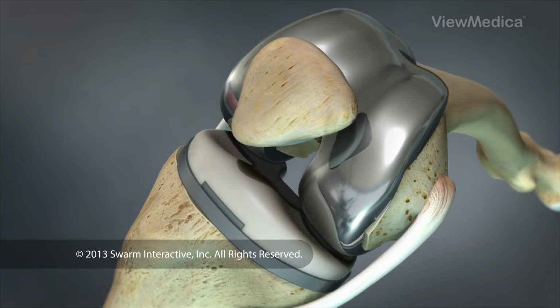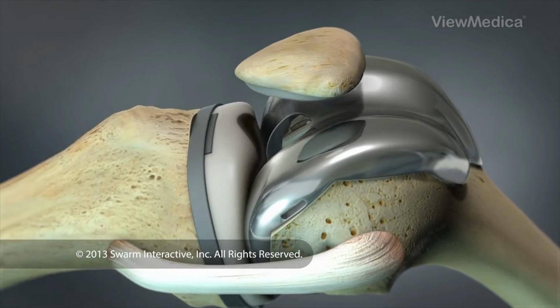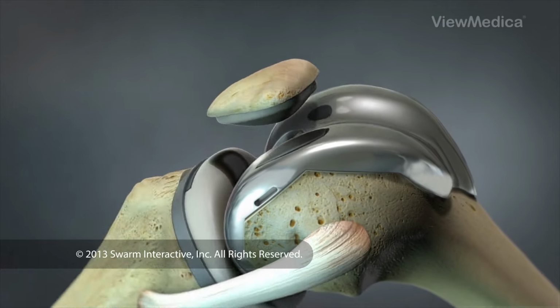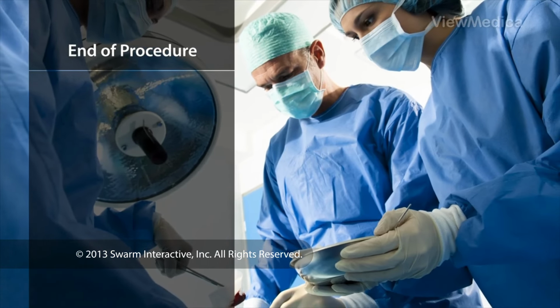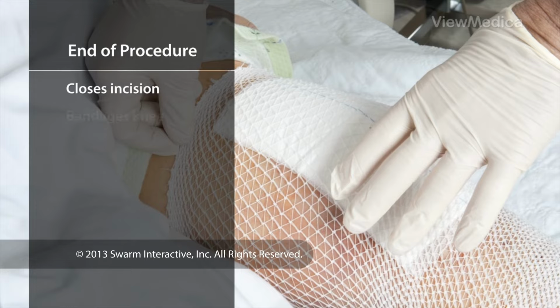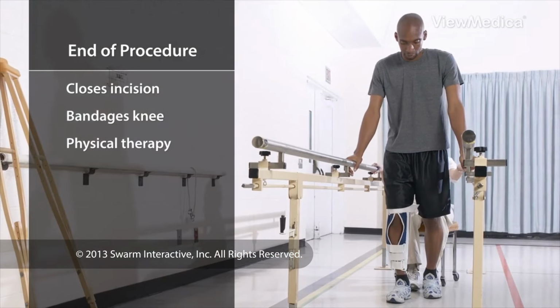range of movements. The surgeon checks to make sure the knee flexes and extends with a fluid and natural motion. When the procedure is complete, the surgeon closes the incision and bandages the knee. Physical therapy is an important part of recovery.